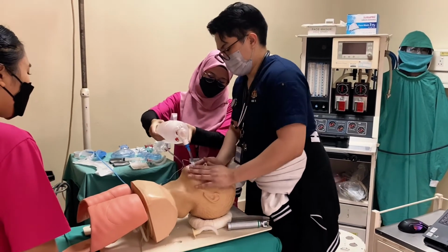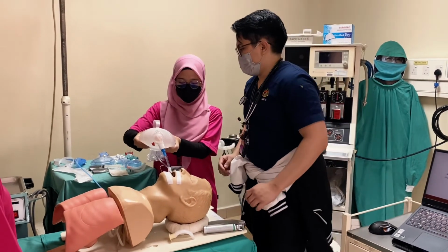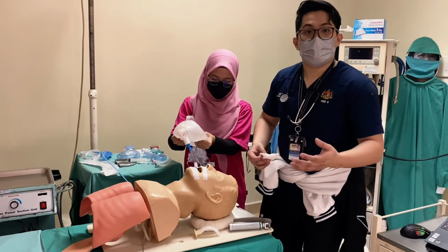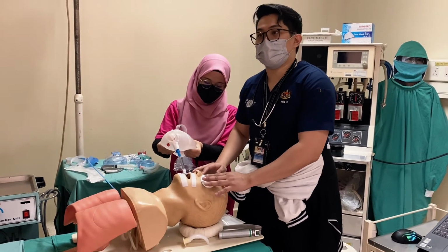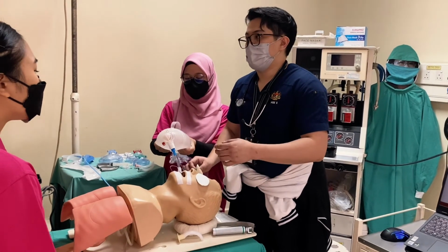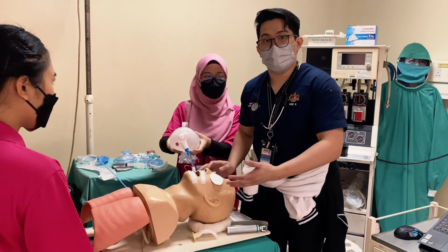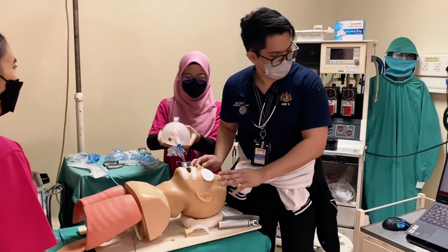Okay. This is one example of the post-intubation management that will be done after that. For instance, in certain cases, like in the operating room, it's crucial that we close the eyes as well to prevent any foreign body from going into the patient's eyes, in the long term, or in any case that involves a harmful substance that may affect the eyes. It's just an example.